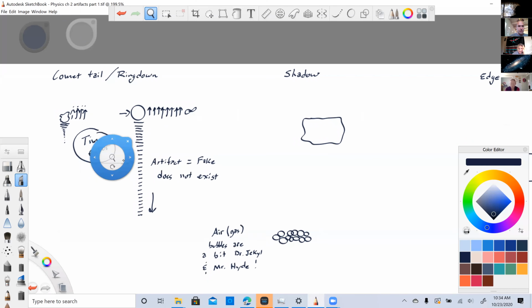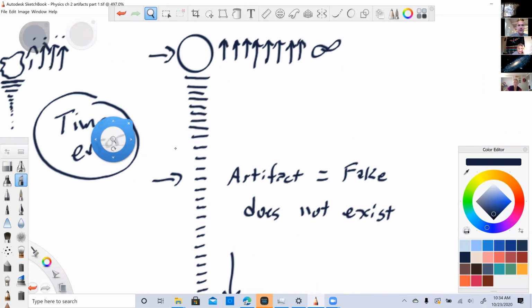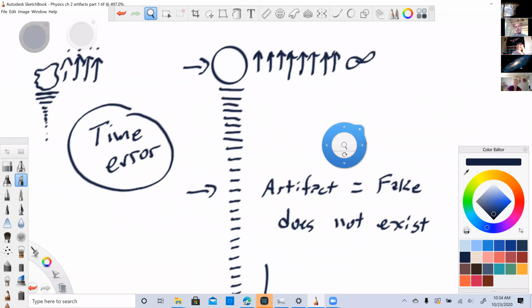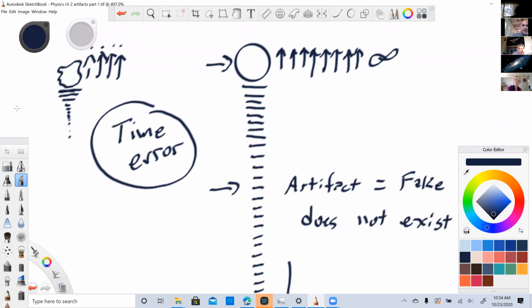The shadow knows. Now shadows are often, and by the way, these are helpful. I should tell you what's helpful and what's not. These are both helpful. This comet tail, if I find that coming out of the wall of the gallbladder, I know the patient has a condition called adenomyomatosis. It's just crystals of cholesterol stuck in the gallbladder wall. So that really helps me.